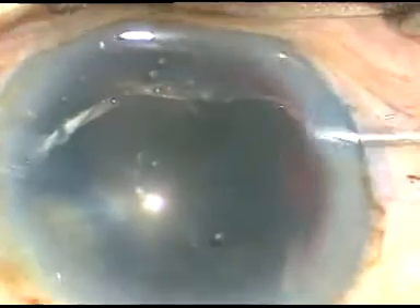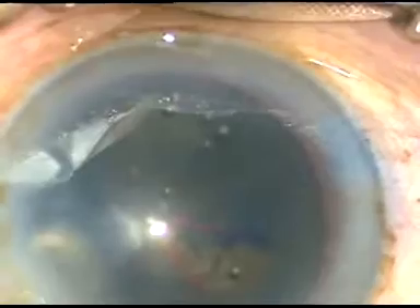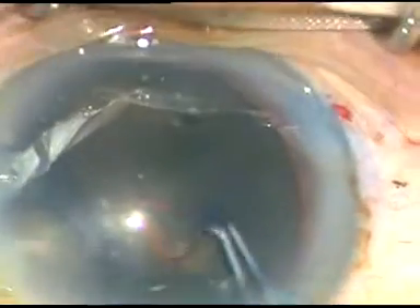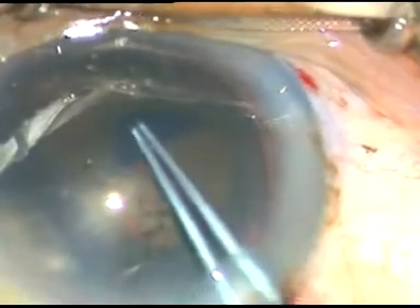This is a 26-gauge bent needle. I'm using this to incise the anterior capsule and raise a capsular tag. I hold this tag with a Utrata forceps, go anticlockwise, and perform a very large capsular rhexis — quite large, about 6.5 millimeters or even 7 millimeters.